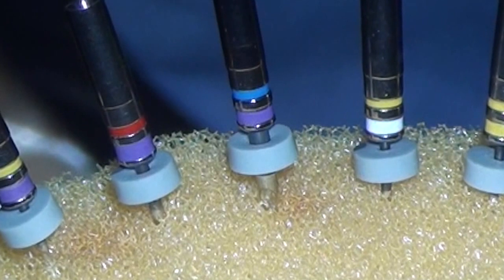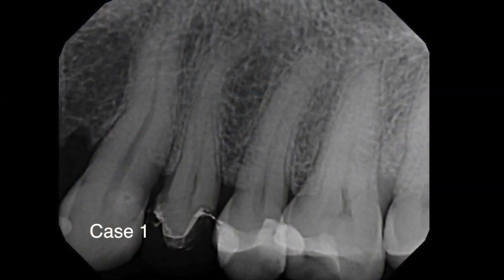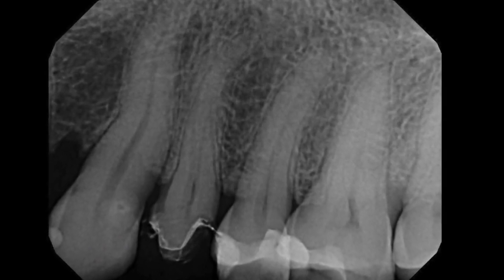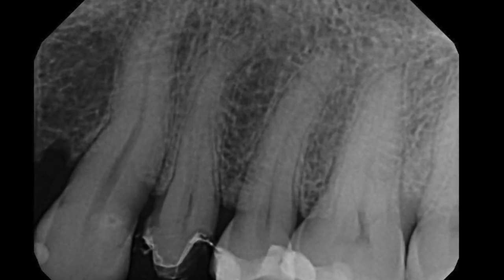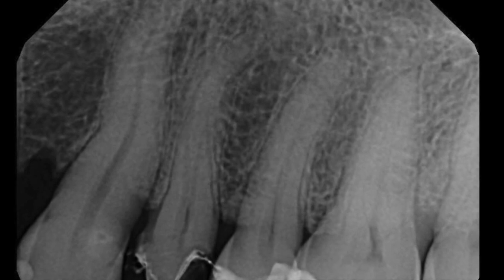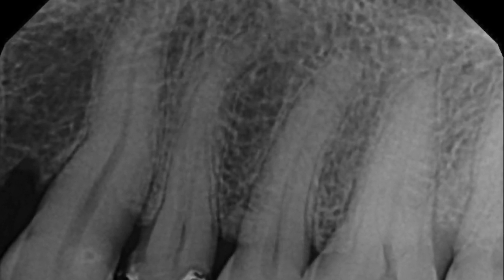The first case I'm going to show you is a premolar — tooth number 13, maxillary left first premolar — which shows on the radiograph to have somewhat of an apical curvature and some calcification. These cases are pretty common, and usually what you need to do is prepare the diameter to a specific size first before you can safely negotiate rotary instruments down to the apex.